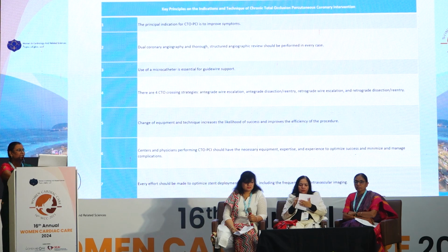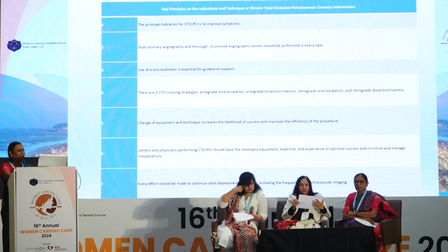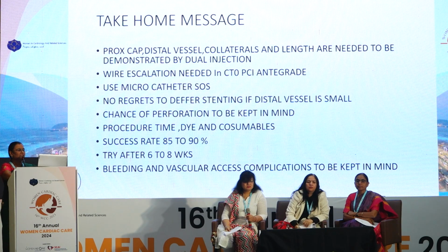Change in the equipment is very important. You need not keep on probing with the same guide wire, so we have to change it. The center of excellence also plays a certain role. Every effort should be made to optimize the stent deployment, which was not possible in our case. Proximal cap, distal vessel, collaterals and length need to be demonstrated by dual injection.